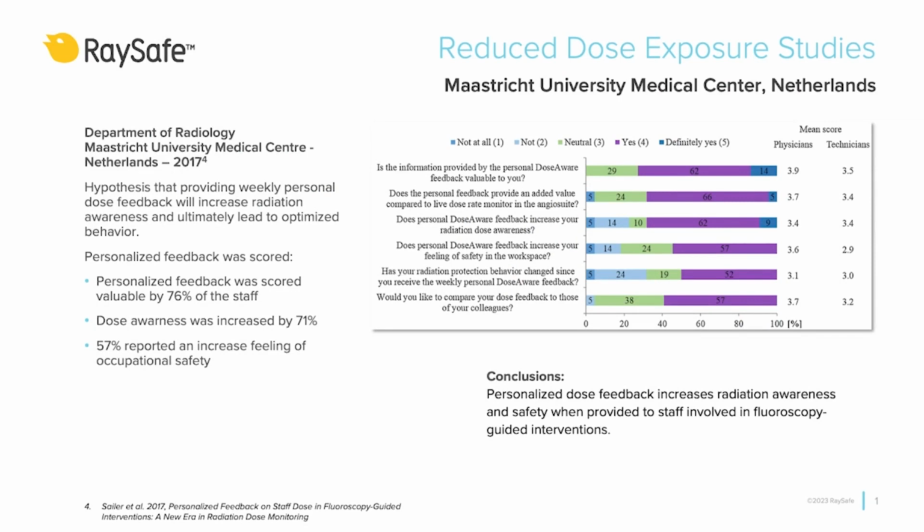This study consisted of 2 phases. For 5 months, staff did not receive personalized dose feedback and dose data for each procedure was prospectively collected. For the next 3 months, staff received weekly individual personalized dose feedback. After 8 months, the dose feedback was evaluated anonymously through questionnaires.